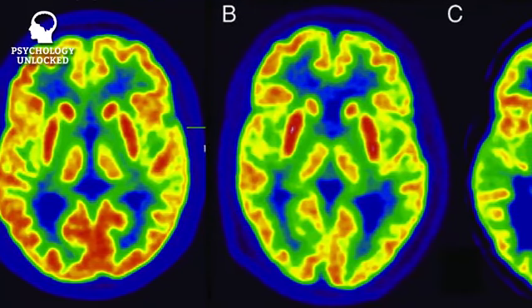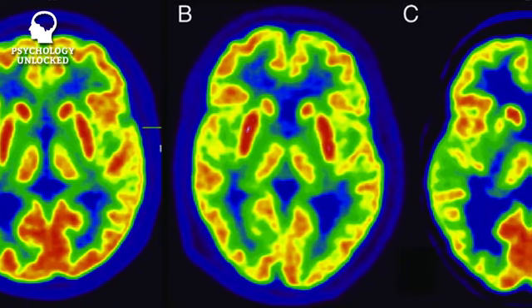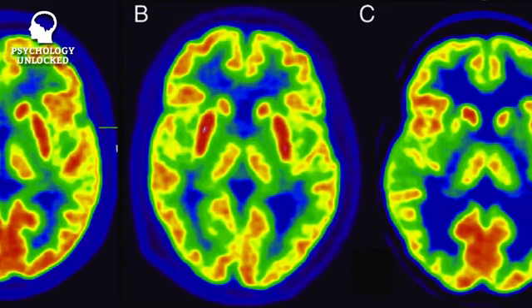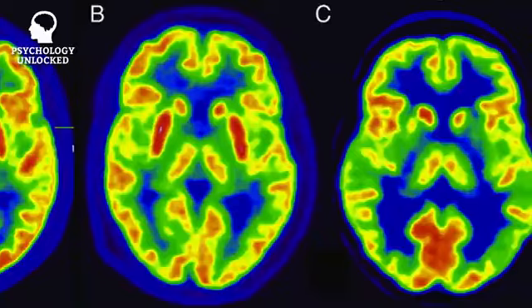As the substance injected into the bloodstream is radioactive, it releases positrons. So the scanner is recording areas of positron emission. It's sort of in the name. And highlighting these areas as areas of functional activity by producing a multicolored image of the brain that looks something like a heat map. None of these machines are cheap. A single machine costs upwards of $1 million, and that's before we consider the operating costs, training and maintenance.